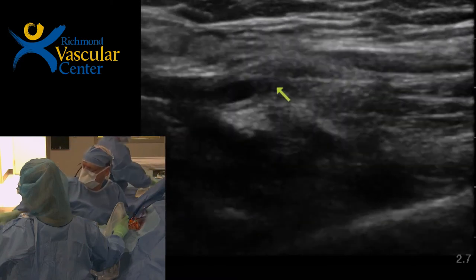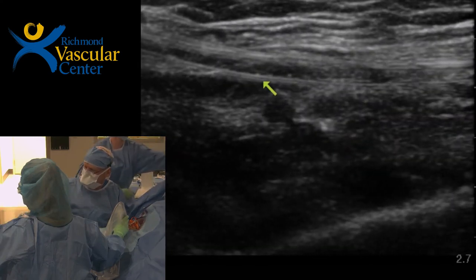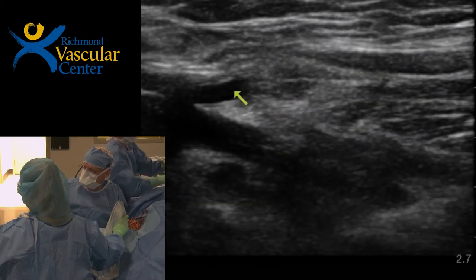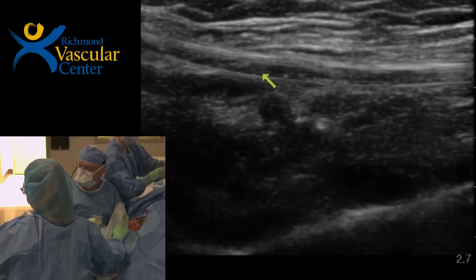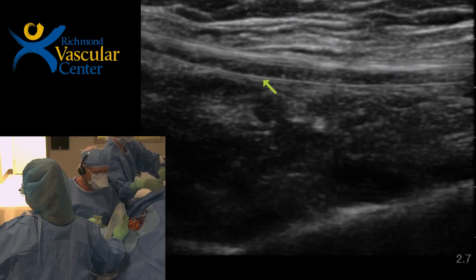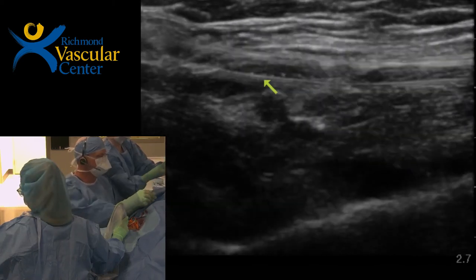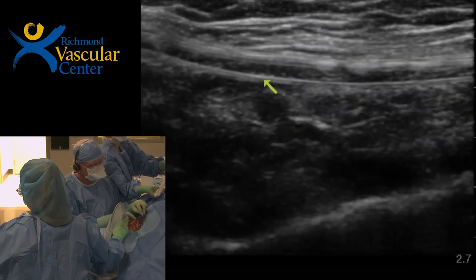Okay, so she's showing you there's the proximal radial artery, and it's always medial to the perforating vein. So you can see the sheath in the perforating vein as she moves lateral, then you see the artery. So that's the little bit of artery we're going to capture. We just want to make sure we've clearly identified that site because that's where we're going to close the device. And I also have marked it on the skin, and I think that's a good habit when you first start, so that if all of a sudden your crossing point looks like it's somewhere way different, you can sort of say, I wonder if I'm in the right place.